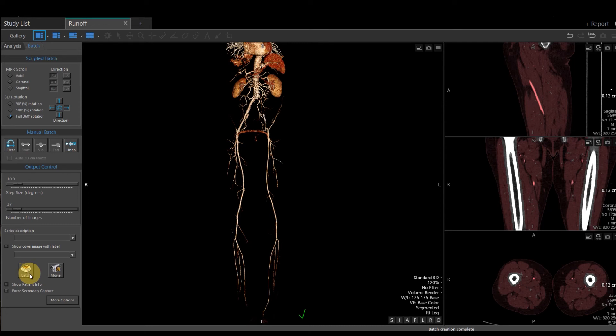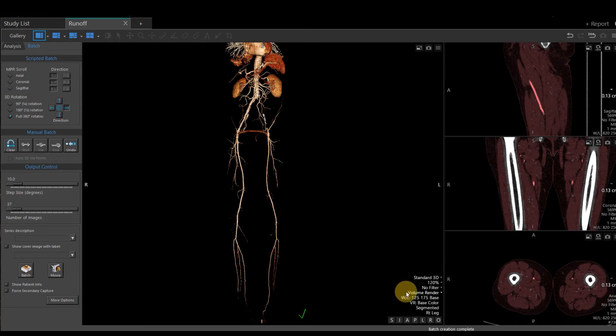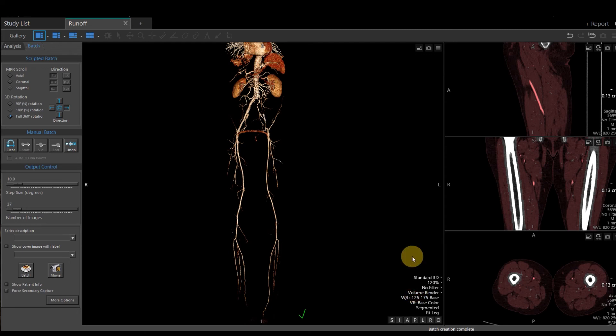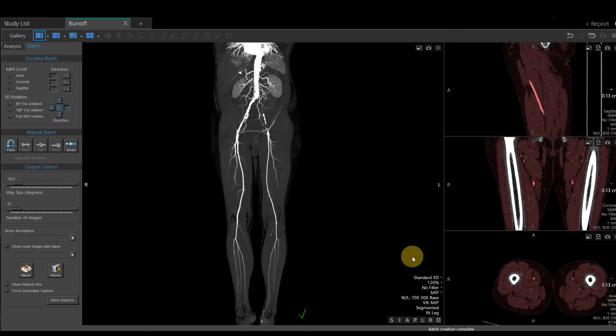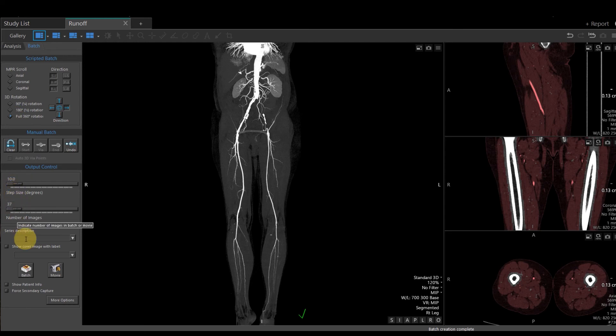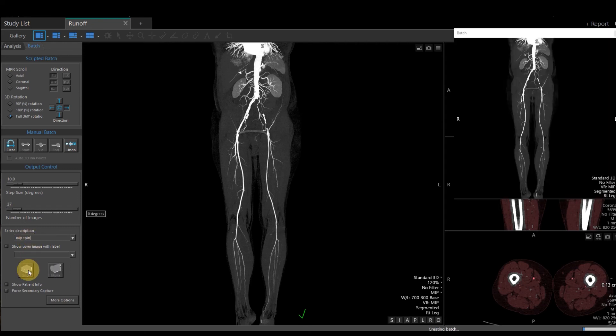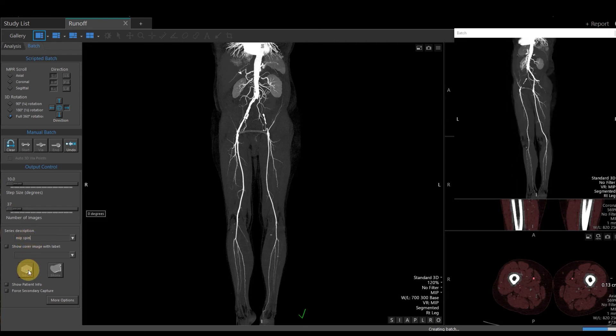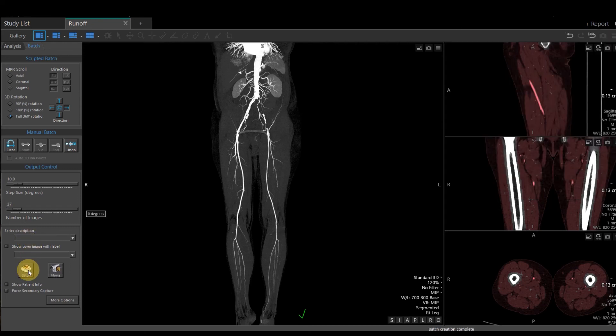If I would like to create a MIP image, a quick way is on the right-hand side, down at the bottom right where it says Volume Render, left-click Volume Render, and then I can change that to a MIP image. I have a full 360 degree rotation, 10 degrees turn. This time, I'm going to name it MIP Spin. Select batch, and that's going to rotate my 3D image again.